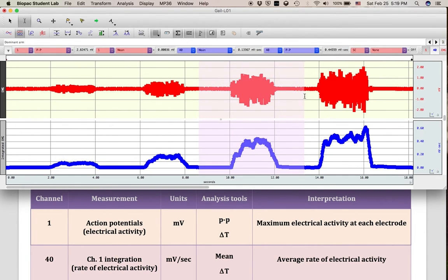And if I extend that before and after the clench effort into the tonus regions, it doesn't affect my peak-to-peak because the maximum and the minimum value are contained within the clench effort.